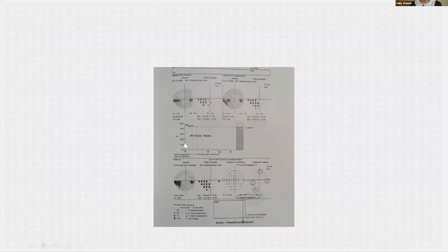And the map essentially looks like this. So it has the list of the visual fields all put together, and it will give you essentially a suggestion or a recommendation at the bottom of that.